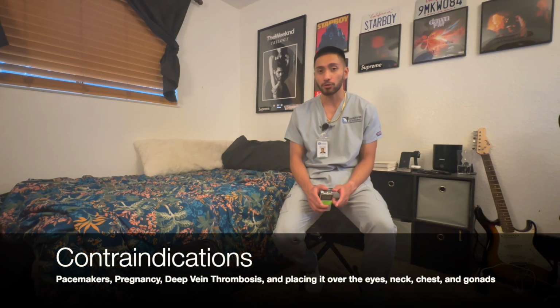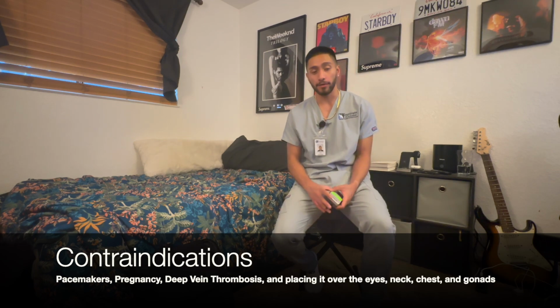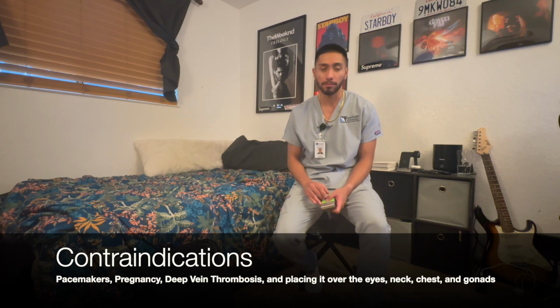As for contraindications, when we're going to avoid using a TENS unit, that's going to be if a patient is pregnant, if a patient has any pacemakers, deep vein thrombosis, and we're definitely not going to be placing these around their eyes, around their neck, because we want to avoid the carotid artery, onto their chest, and lastly, we're not going to place it on their gonads.